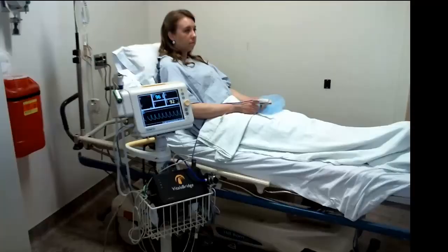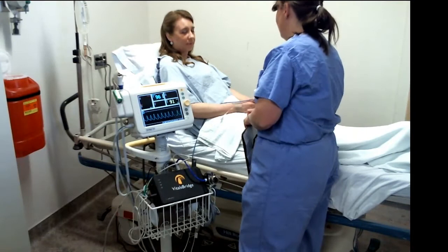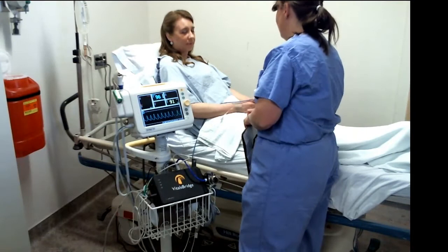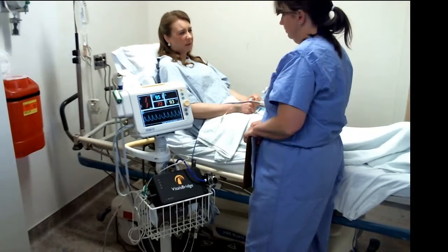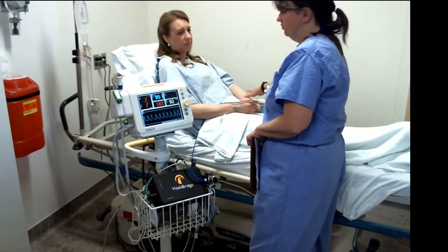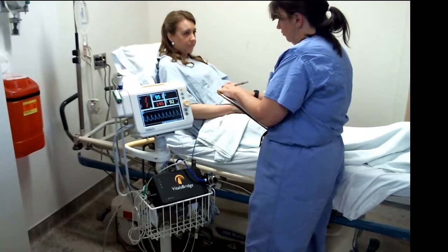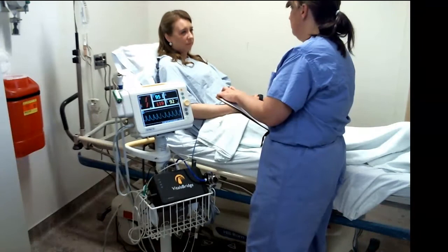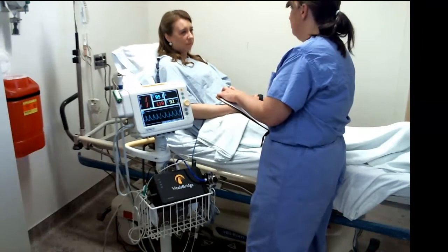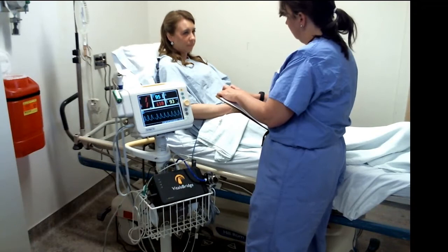The nurse Diane introduces herself to patient Annalise and prepares her for surgery. She asks about the last time the patient had anything to eat or drink, takes her blood pressure, confirms the signed consent, and explains what will happen on the way to and from the operating room. She also asks the patient to remove her earrings before transport.